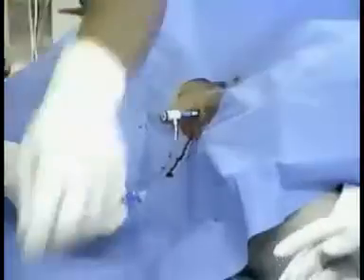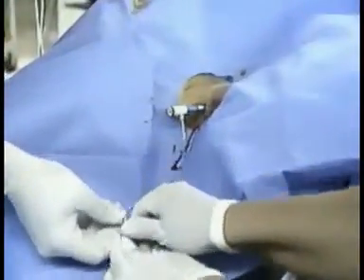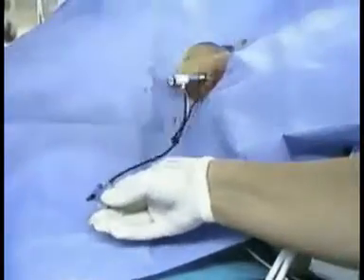The free return of blood through the side port after the stopcock has been opened confirms the intravascular location of the introducer. Place a suture through the skin about a ½ centimeter from the catheter hub to form an anchor.